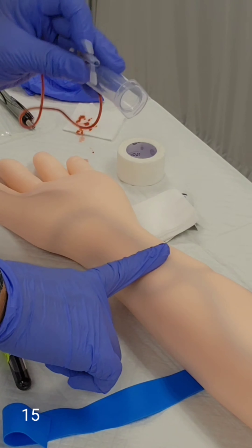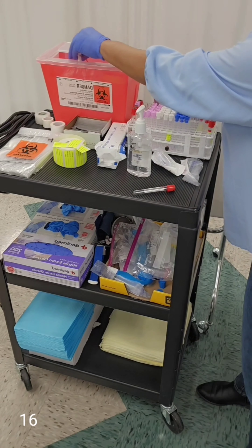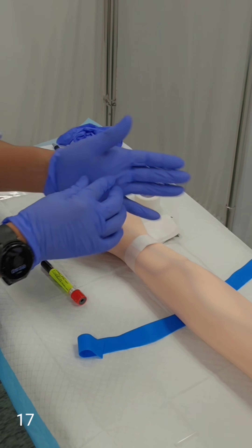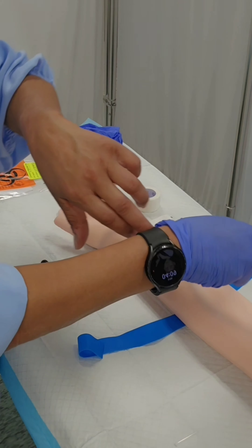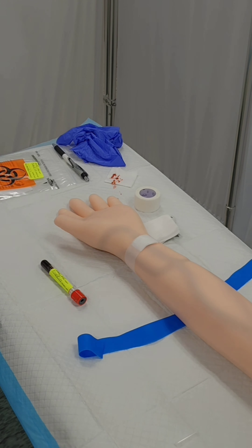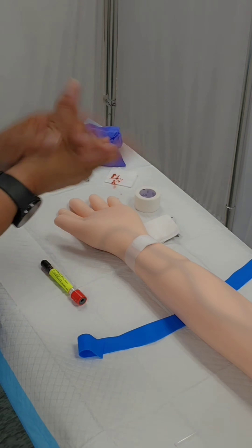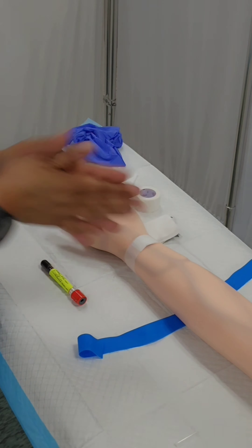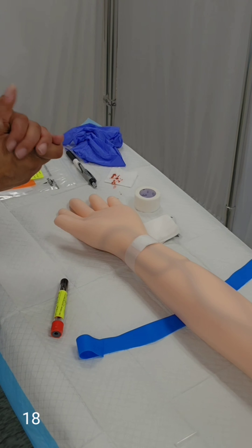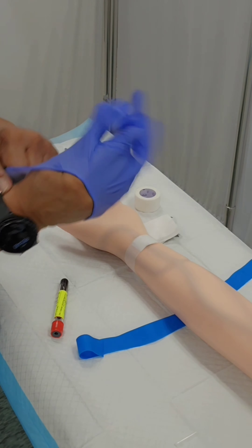The vacutainer I'm going to place in the sharps container. Now I'm going to remove my gloves without contaminating myself and discard them into the waste bin. I'm going to use a little hand sanitizer to sanitize my hands and make sure I get them all nice and dry.